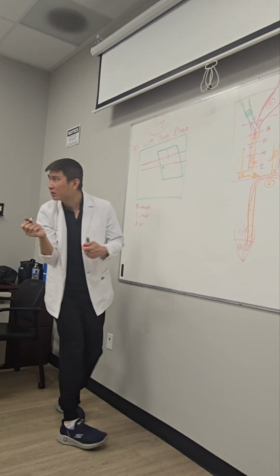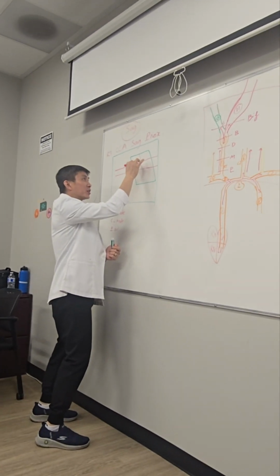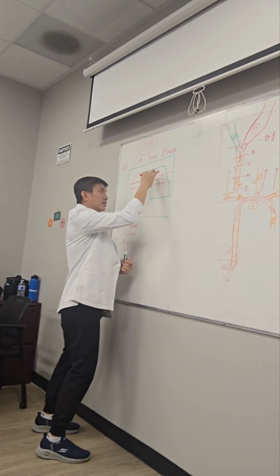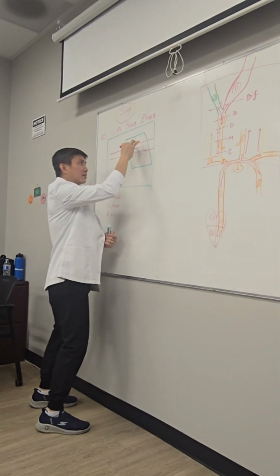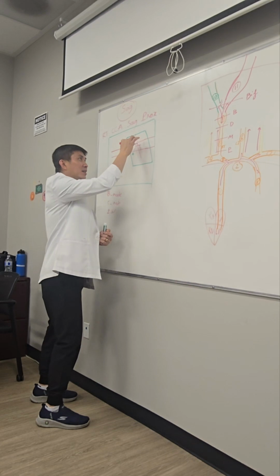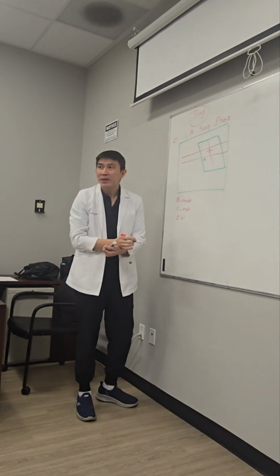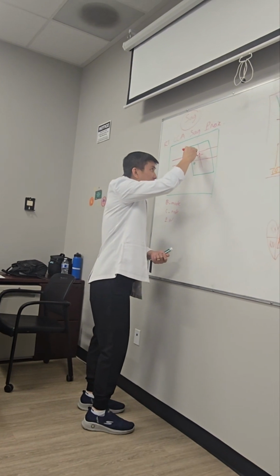In here is the sample volume, and this is the line.